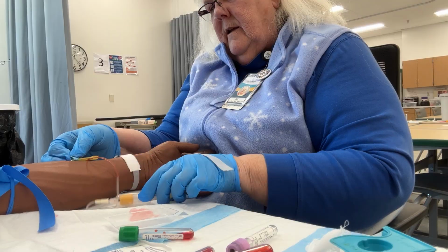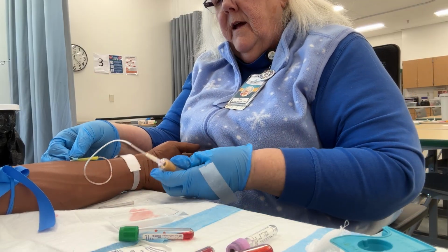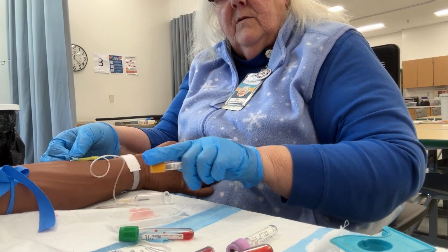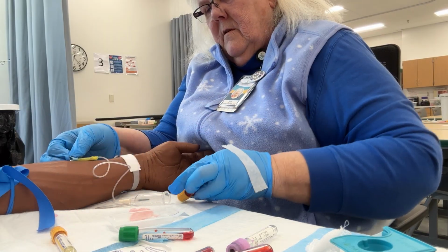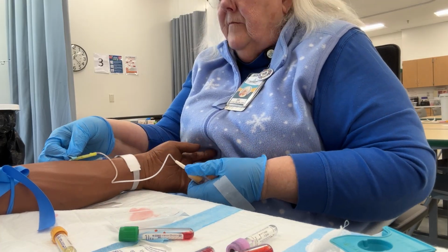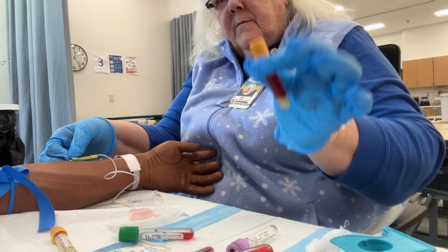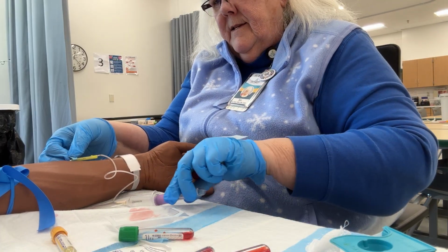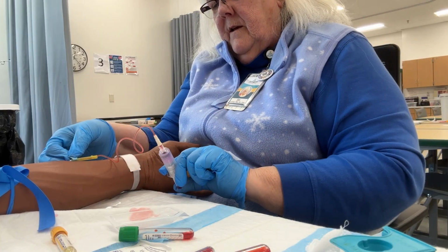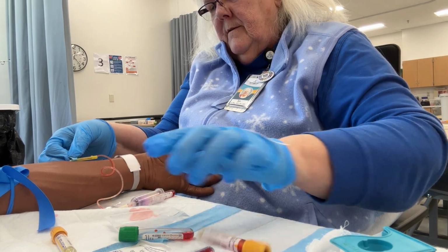All right, let it draw. Okay, it appears as though I have a little bit of a dud on that gold top. And then I got this tube. Then I'm going to do my last one, which is lavender. Okay. That one draws.